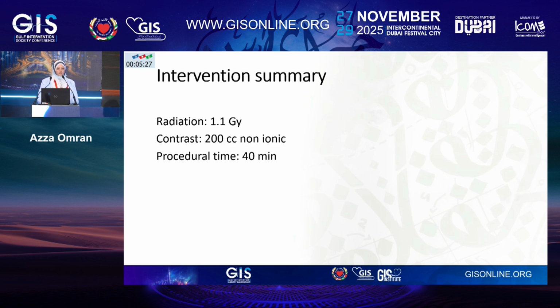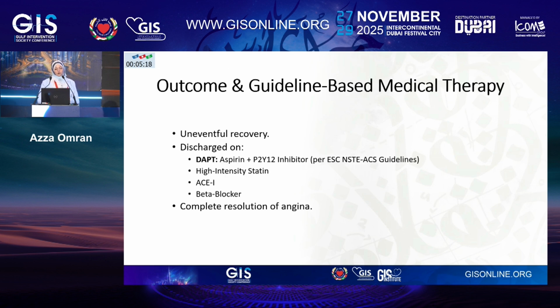So our intervention summary: we had 1.1 gray radiation and contrast of 200 milliliters. Procedural time was nearly 40 minutes. The patient had an uneventful recovery, discharged on DAPT and maximal medical treatment with complete resolution of angina.